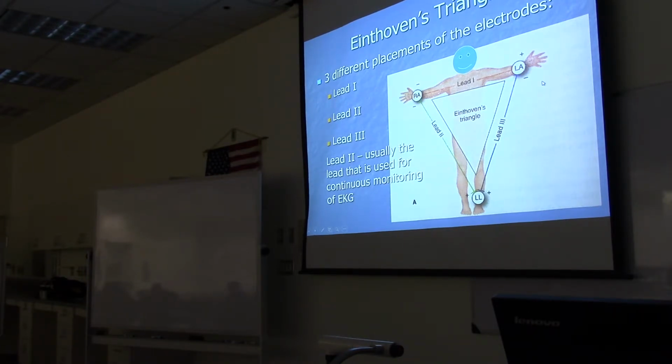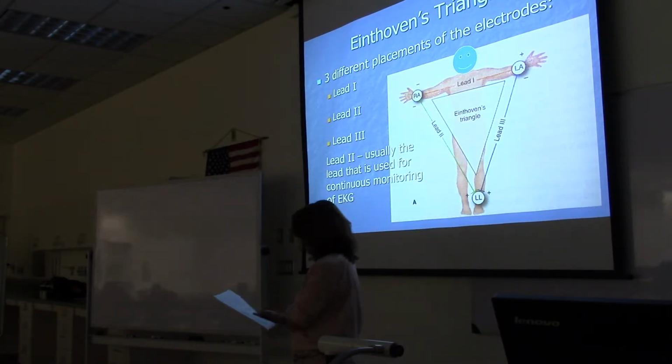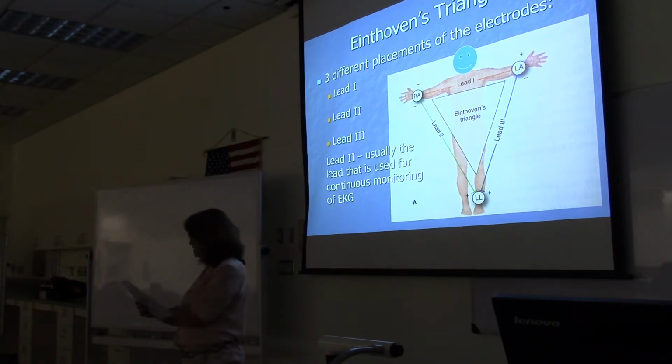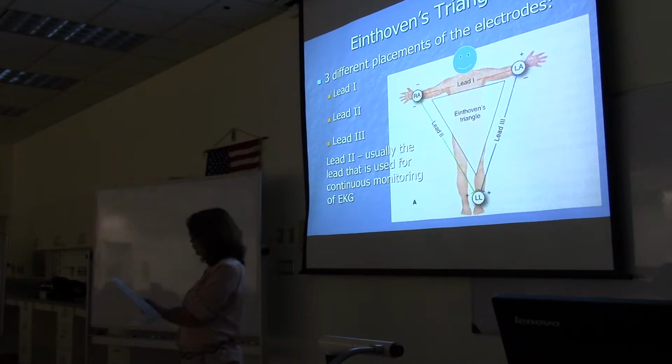What I want you to write down on your paper there is, for the different placements, electrodes are not moved, but the settings on the EKG machine or monitor will change the polarity.